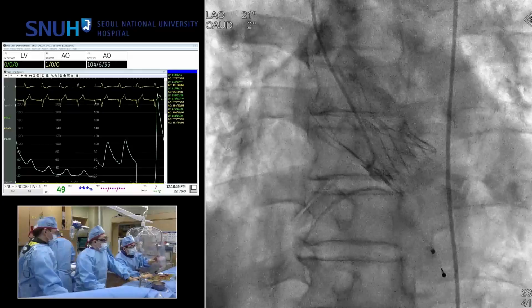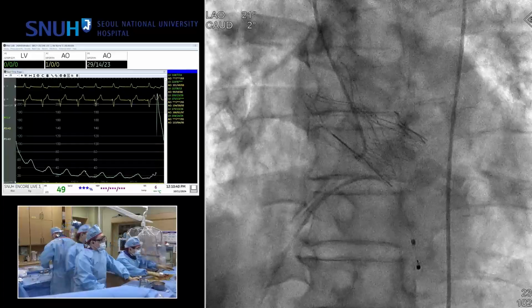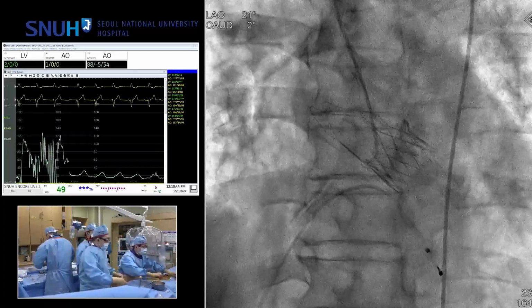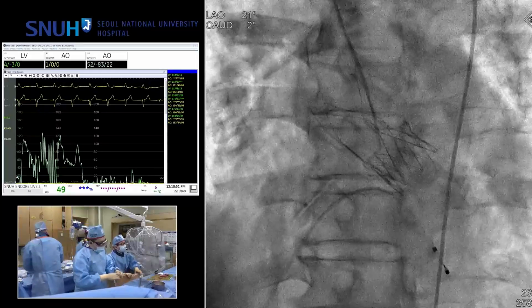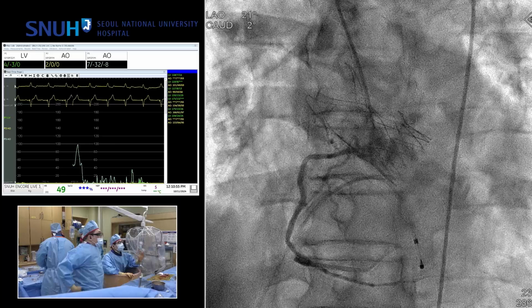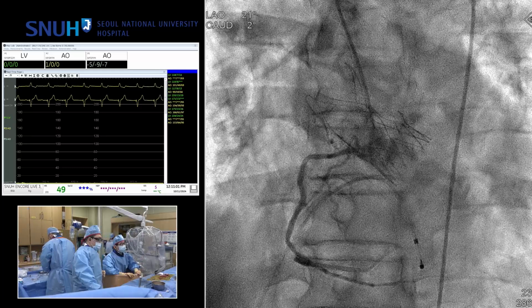There are always the coronary arteries above the upper crown, usually. Thus, it is the beauty of the accurate valve to engage the coronary artery. Not easily, but not so difficult. Of course, it is easier to do a native coronary artery angiography, but it is not so difficult even after accurate valve implantation. Okay, excellent.